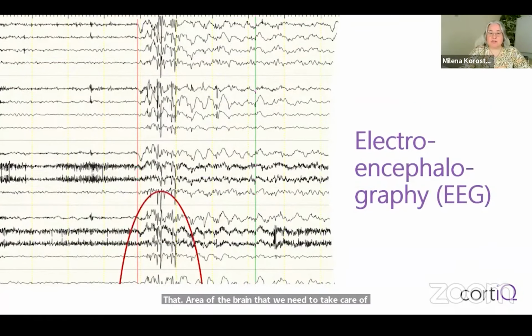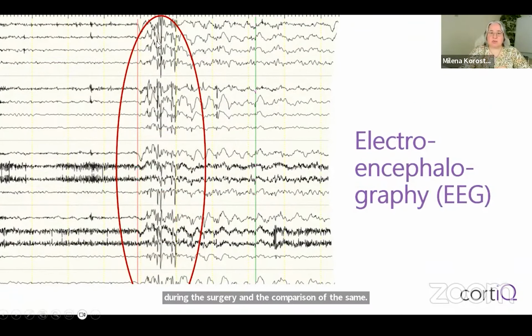And the comparison of the same patient we see here with EEG. Yes, we can say, yeah, it's frontal, but we were not even able to say really well, is it left or right predominance, you see how it is broadly distributed through all the electrodes, so fairly diffuse activity.